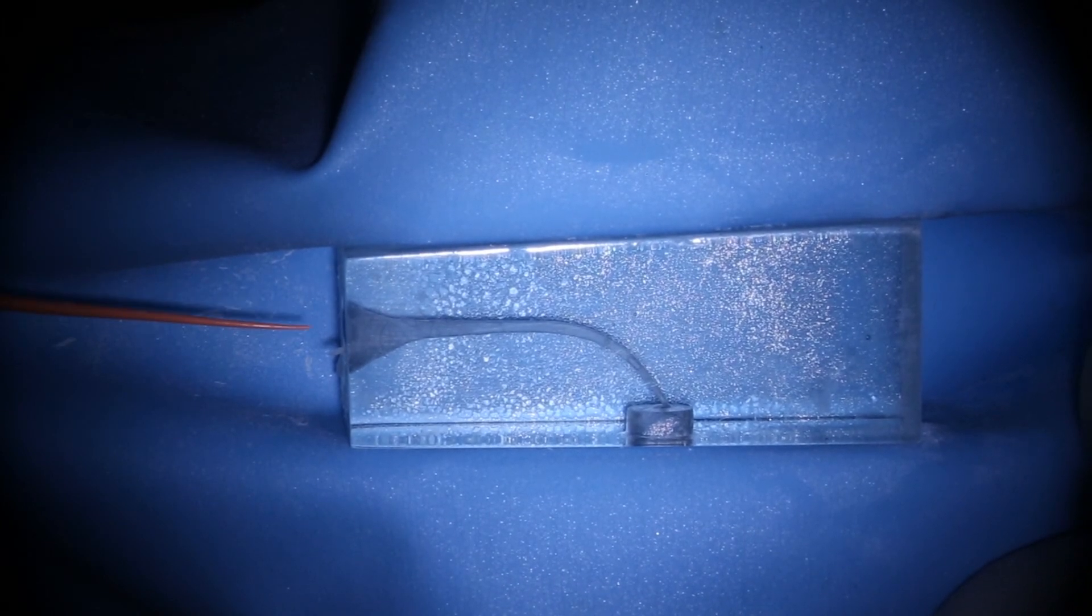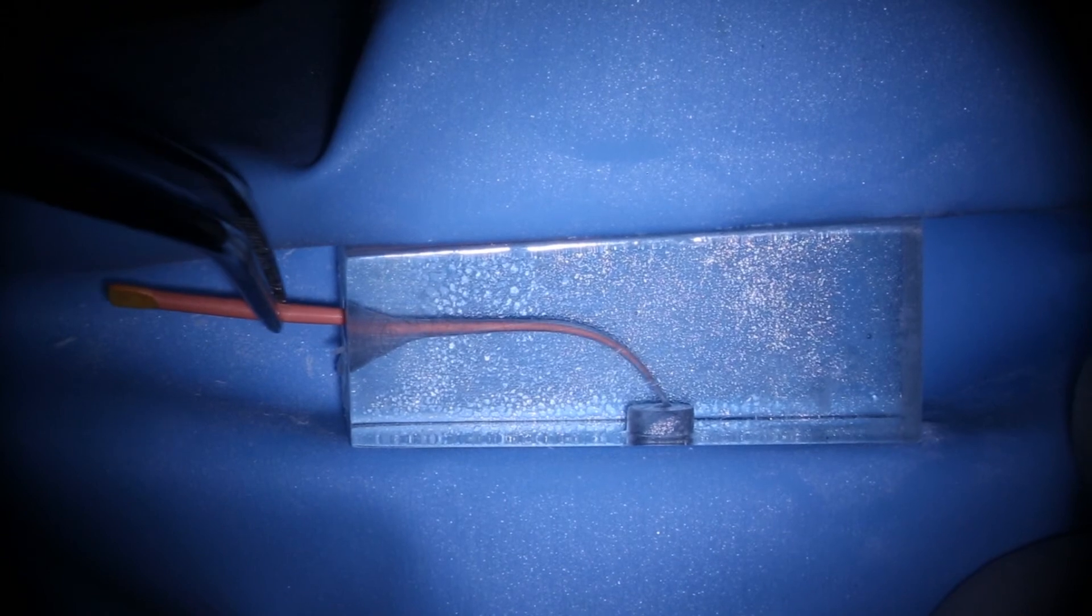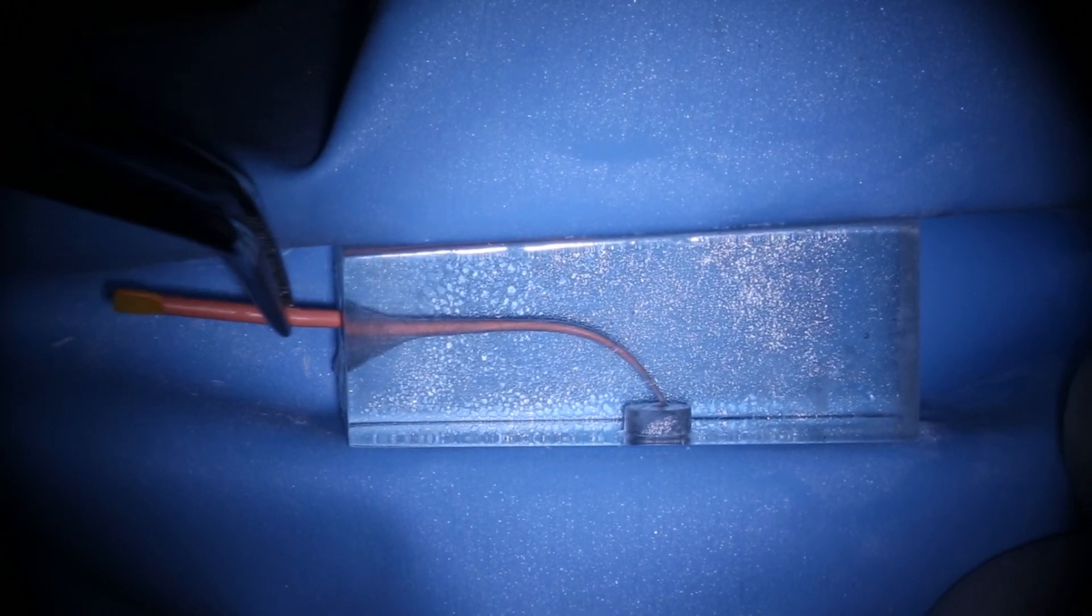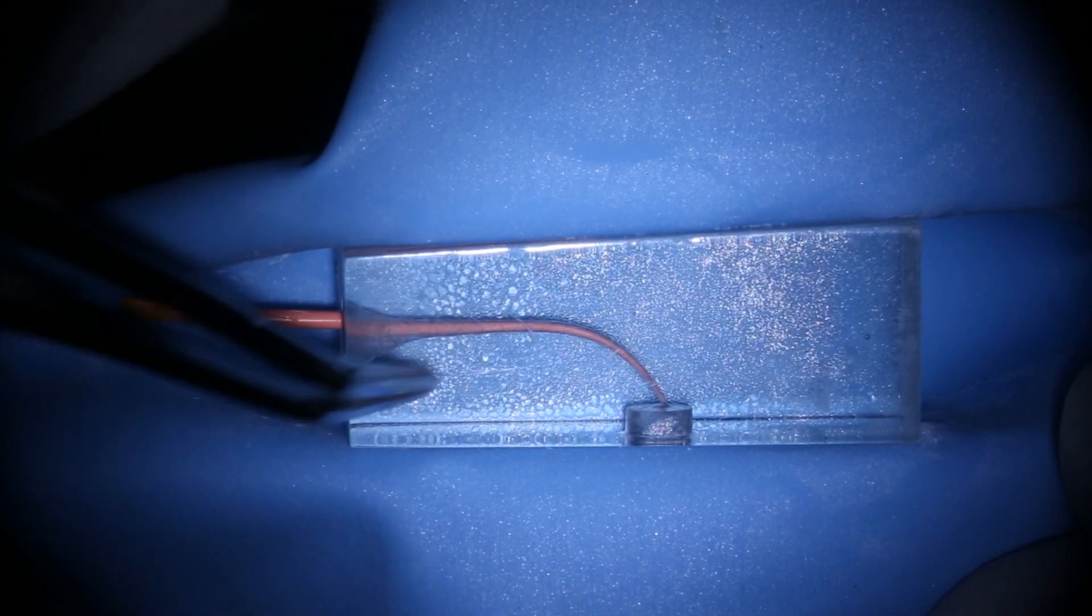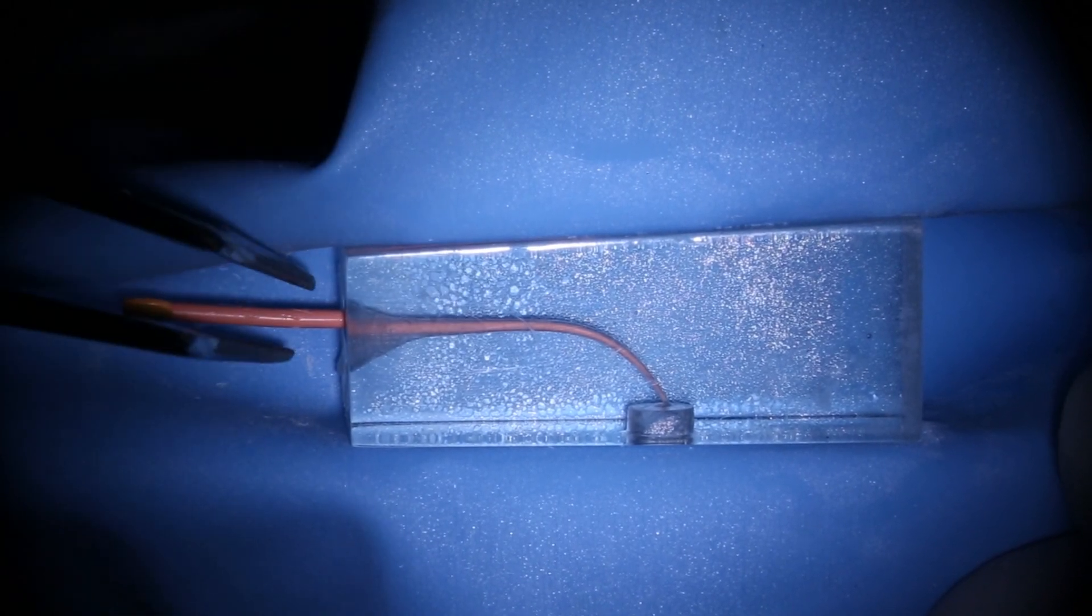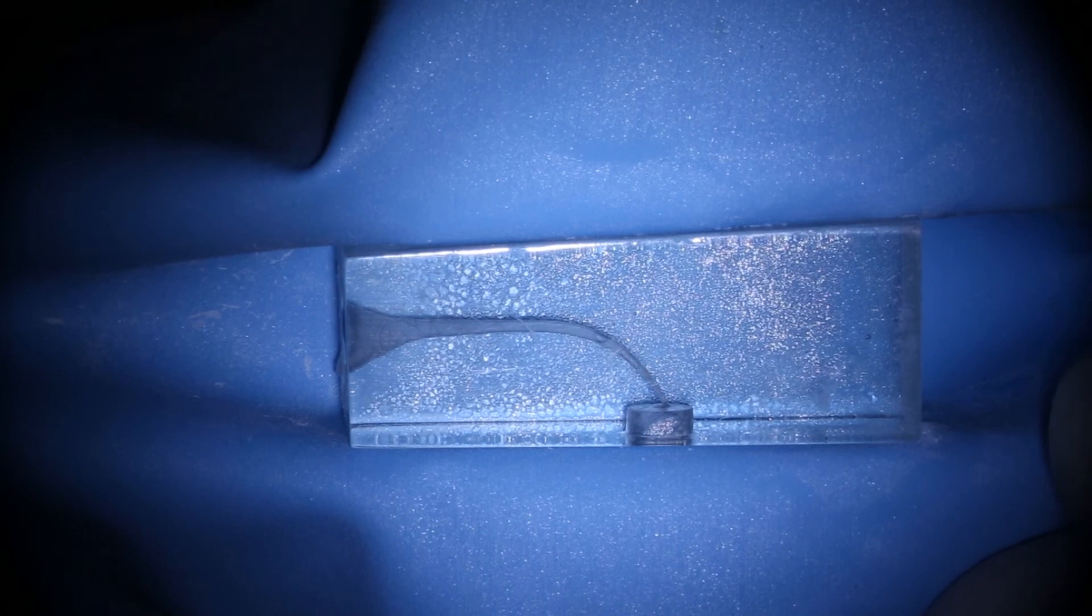So now we go back with our 20.04 cone, and now we are going to see that seat, and the reason we're seating is we're not binding here anymore. We've just changed that slightly to allow us to seat that 4% cone, and that will allow that 4% cone to seat.